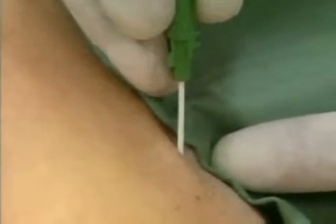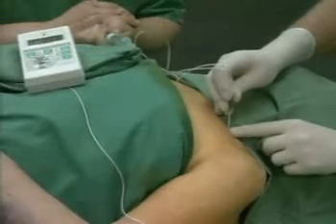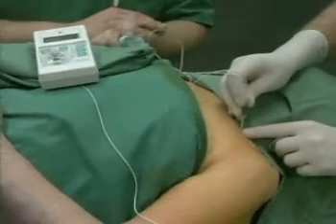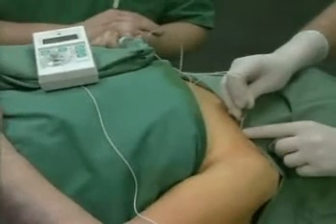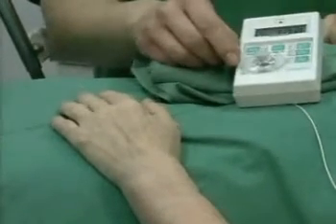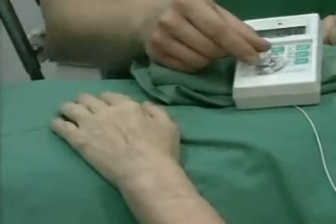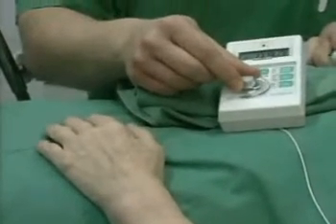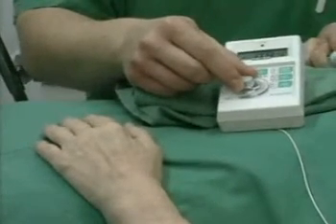An isolated muscular response on the upper or lower arm is not sufficient by itself, and the block will not be successful. The desired motor response is the rhythmic contractions of the finger muscles, shown here. The stimulation current is reduced in steps to 0.3 milliampere.